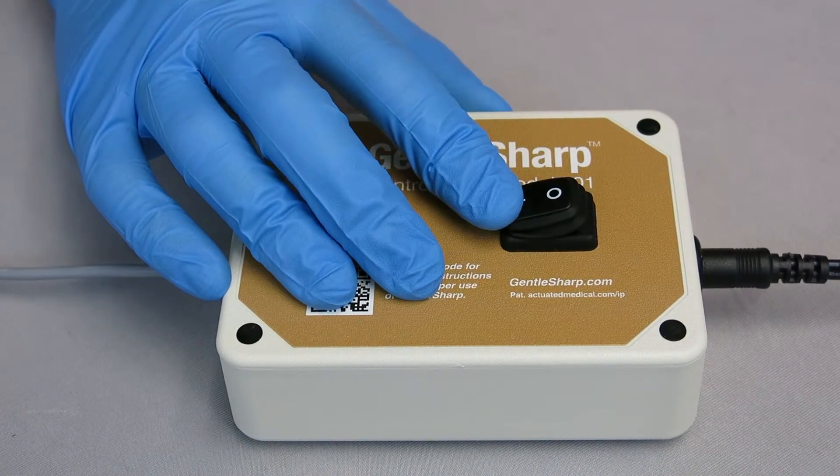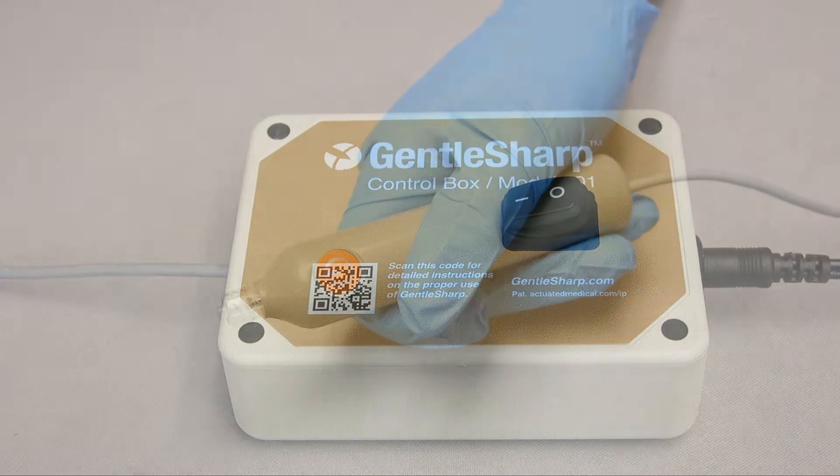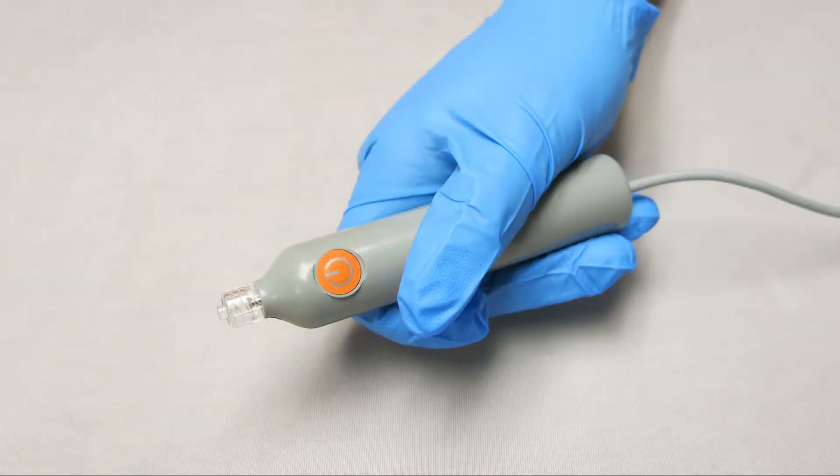Verify the control box is operational by pushing the on-off power switch to the on position. The control box will produce an audible tone when powered on. Note that GentleSharp will not vibrate at this time. The start-stop button on the handpiece causes the vibration. For now, do not press the start-stop button.